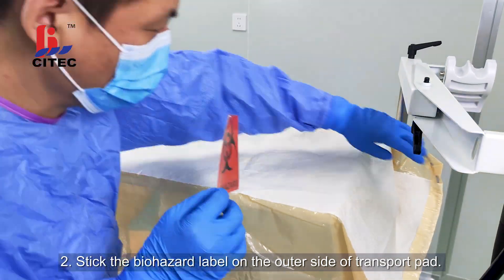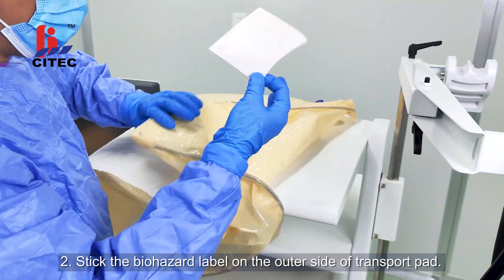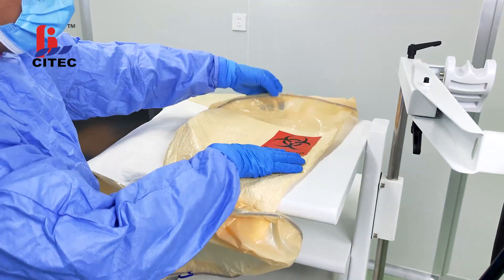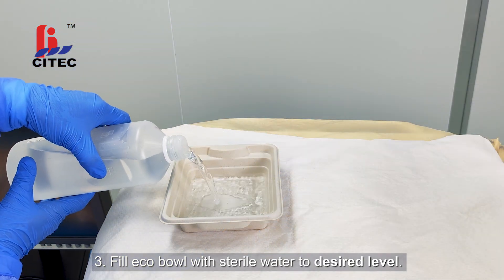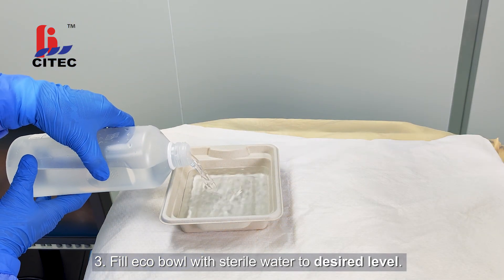Step 2: Stick the biohazard label on the outer side of transport pad. Step 3: Fill eco-bowl with sterile water to desired level.